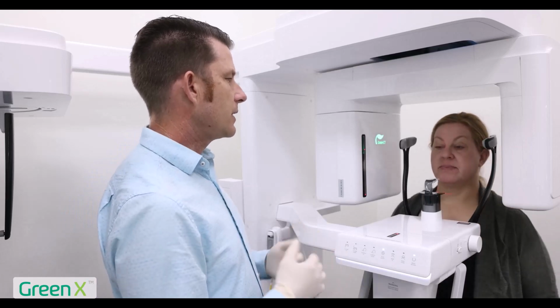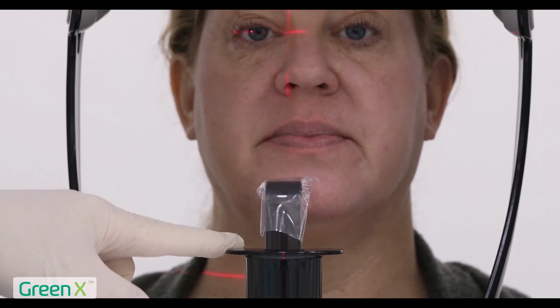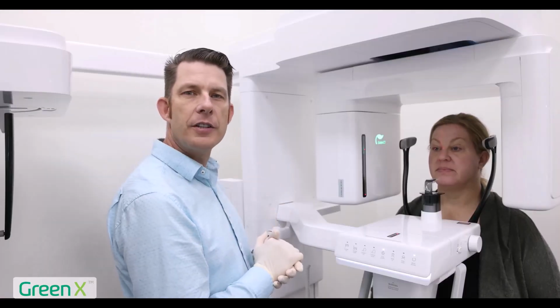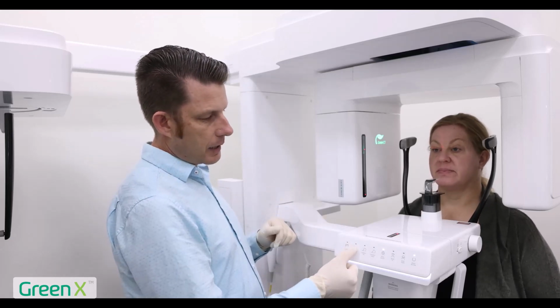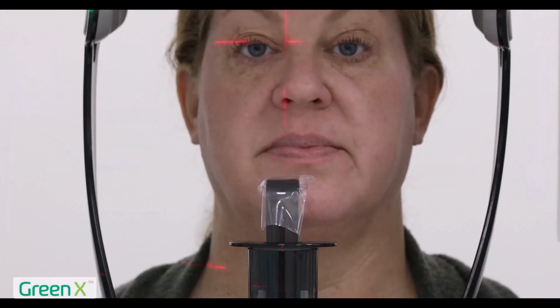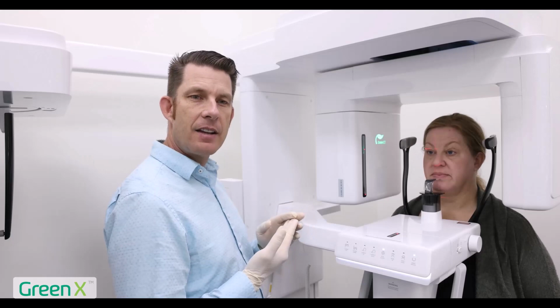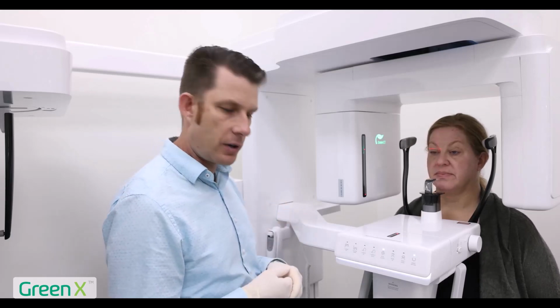Go ahead and stand up straight and tall for me. The first thing I do is evaluate the chin rest to the base of her chin. I want the patient to be able to just put the chin on the chin rest. So I'm going to evaluate that, column up or column down to adjust. Then I'm going to start with the patient's hands, feet, and then finally have the patient bite in the bite stick. So let's start with the hands first.